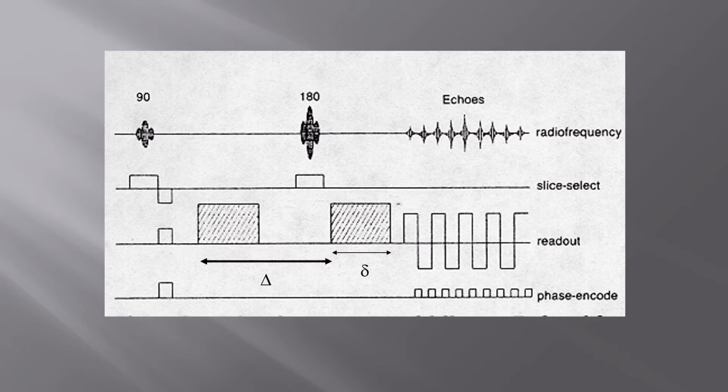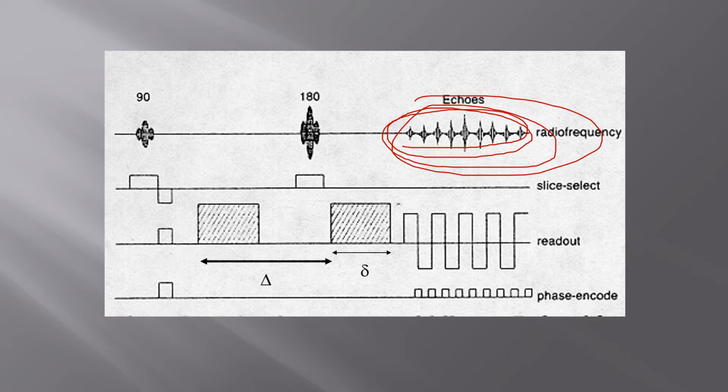Okay, so here's a pulse sequence diagram for diffusion EPI imaging. Here we have all our echoes, as you might expect with the diffusion weighted imaging sequence. Probably would actually have 128 that we'd be obtaining with our sequence. And additionally, with the diffusion or diffusion tensor imaging sequences, there's a couple extra gradients added in here, and this gives us our diffusion weighting. They add some additional directionality to them that help encode differences of water motion within the brain in different directions.